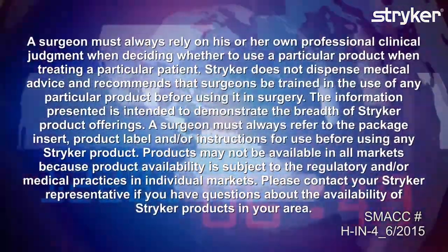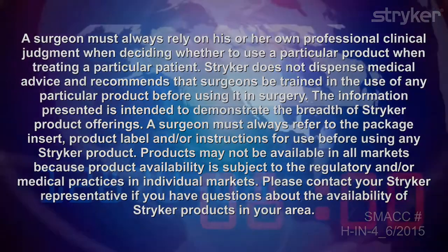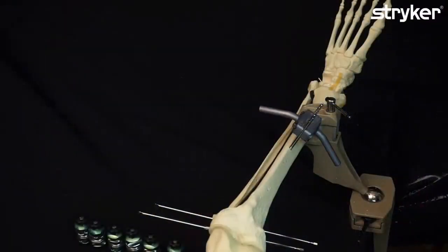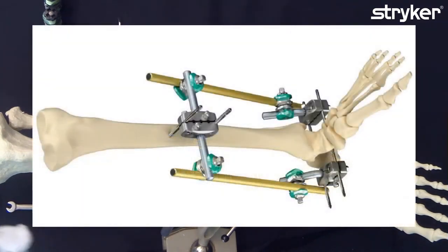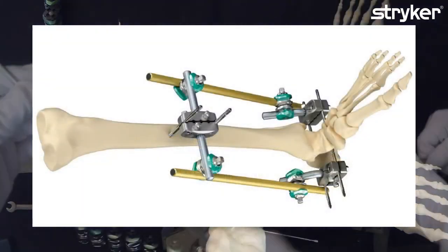Welcome to another edition of our Hoffman 3 knowledge series. We're going to show an ankle frame. This time we are going to use, instead of one transfixing pin, a double construct.